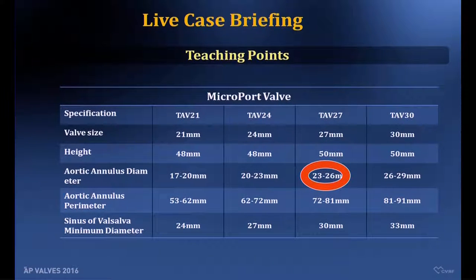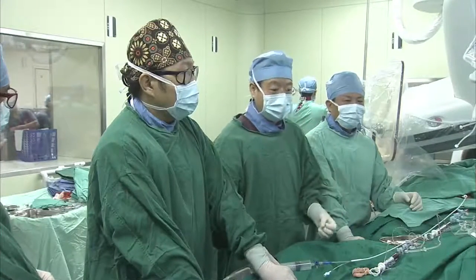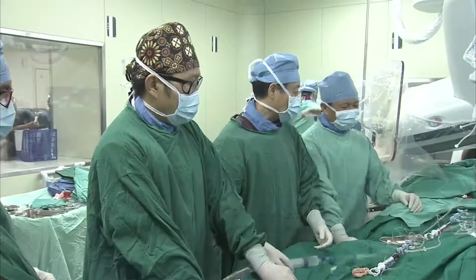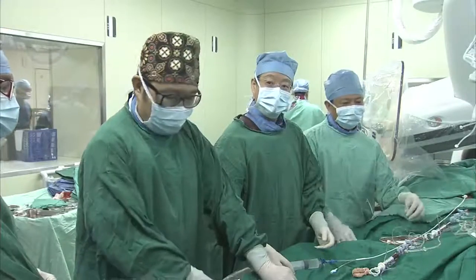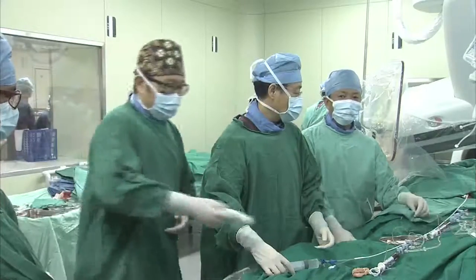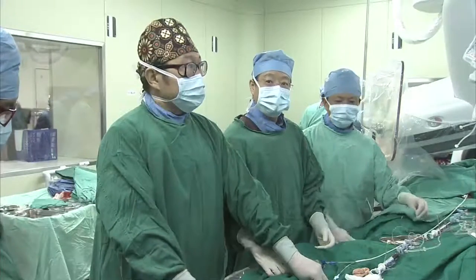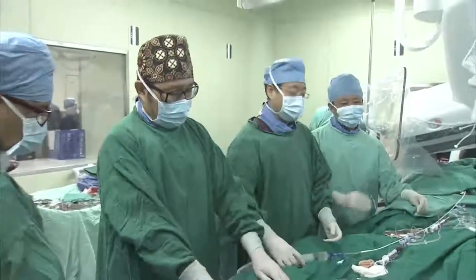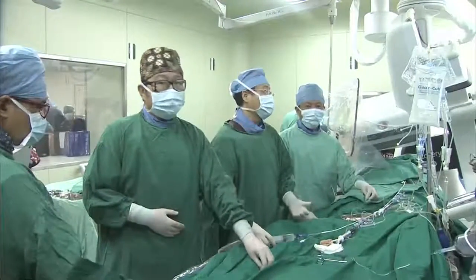Sometimes the CT scan looks like a very severe calcification, but maybe the balloon dilation is not so difficult. But sometimes it looks like a less severe calcification, but it's difficult, like the previous one. It's similar to coronary calcification. From the coronary angiography, sometimes we find the calcification is very severe, but it's very easy to be dilated with the balloon. But sometimes the calcification is not so severe, but it's very difficult to open, very difficult for the stent.